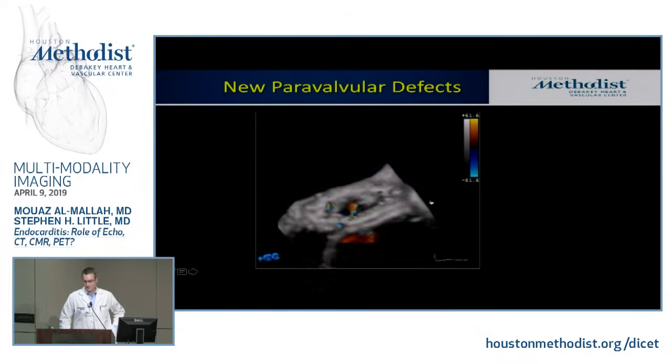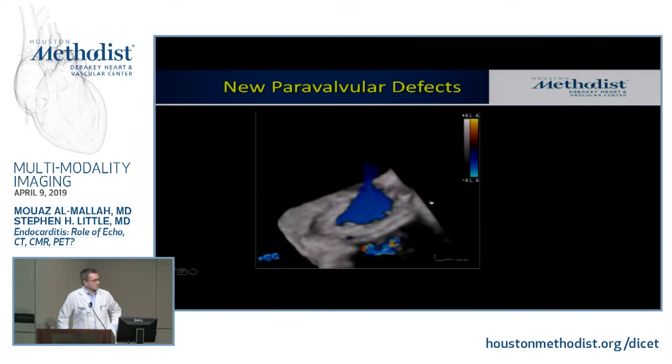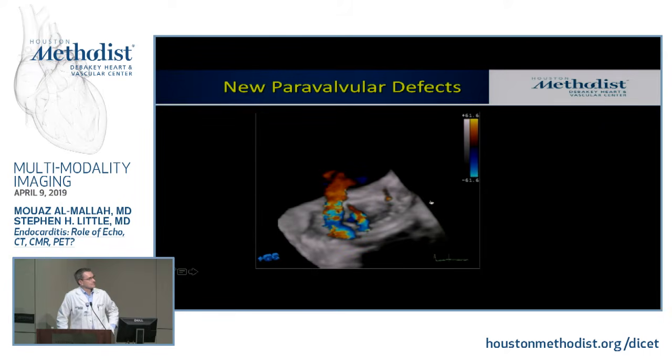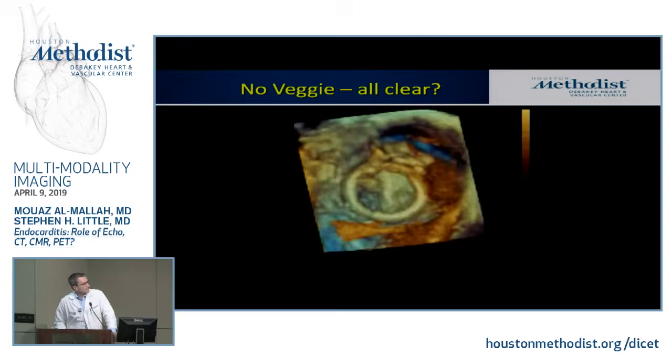So you trade off a little bit of hemolysis for the rest of the life and frequent transfusions. And nowadays we would consider plugging these, but not until they were demonstrated culture negative for several months. I think there's a still image here. There you go. So these are these three discrete paravalvular defects, and then you can see some of the thickening that's been acquired on these bioprosthetic leaflets. So the leaflets aren't normal. The diastolic gradient through the valve is no longer quite normal, basically scarred by endocarditis, but not fatally damaged. So weird case, but that happens from time to time.